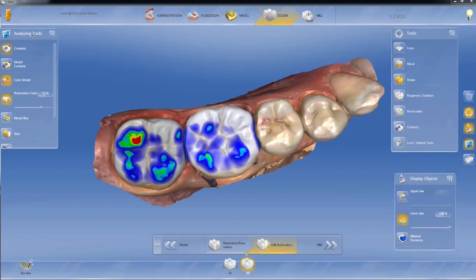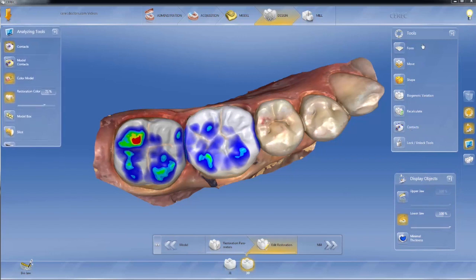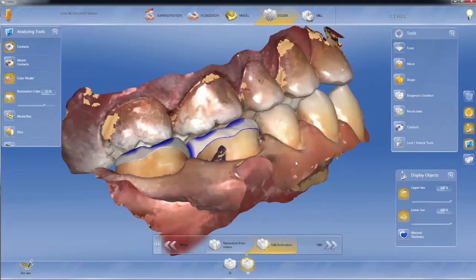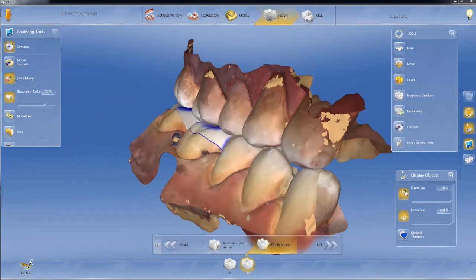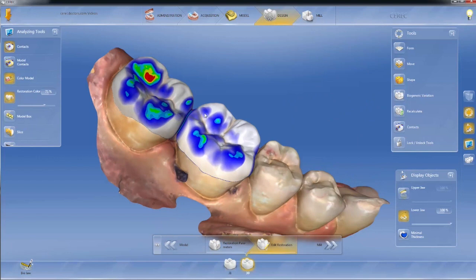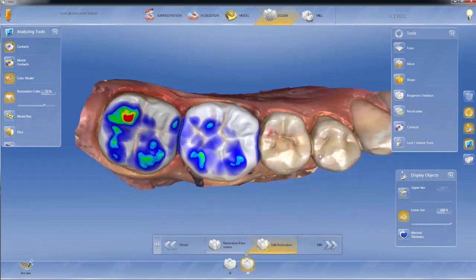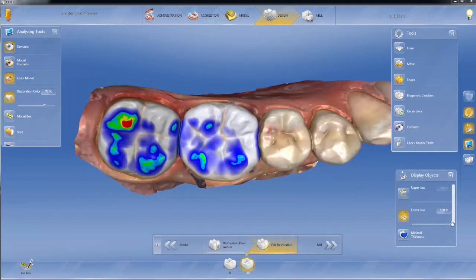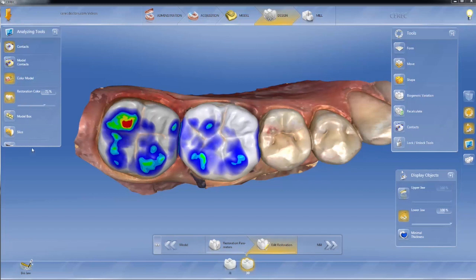I like to have my analyzing tools on the left side, my tools on the right side, and the display objects over here. You may choose something different, but I like to be able to quickly turn stuff off and on and review how everything is looking by clicking things off and on. Instead of circles, we now have slider bars that change the transparency.